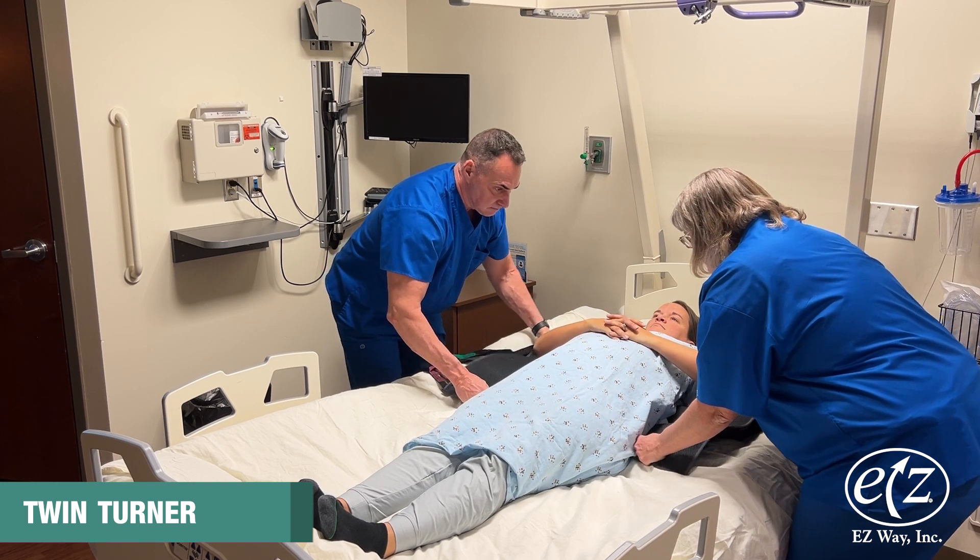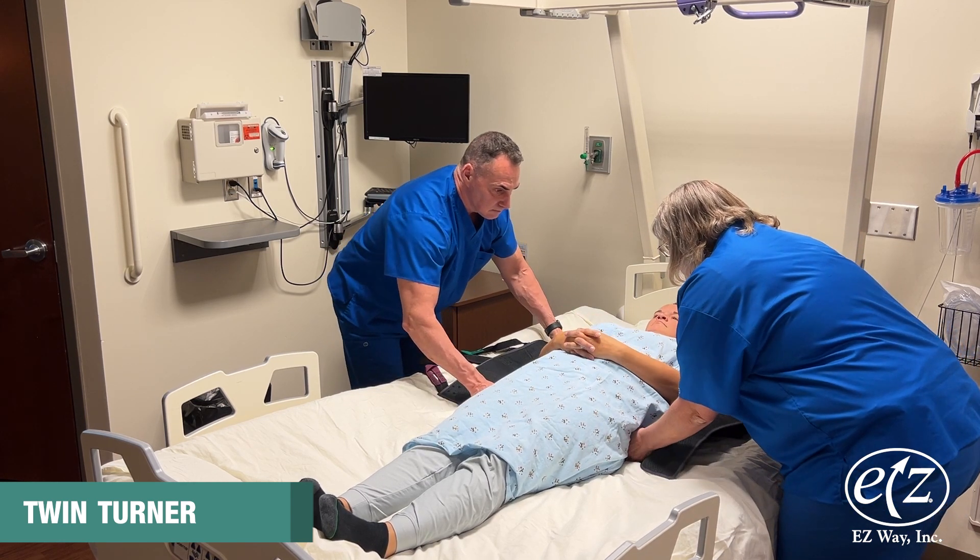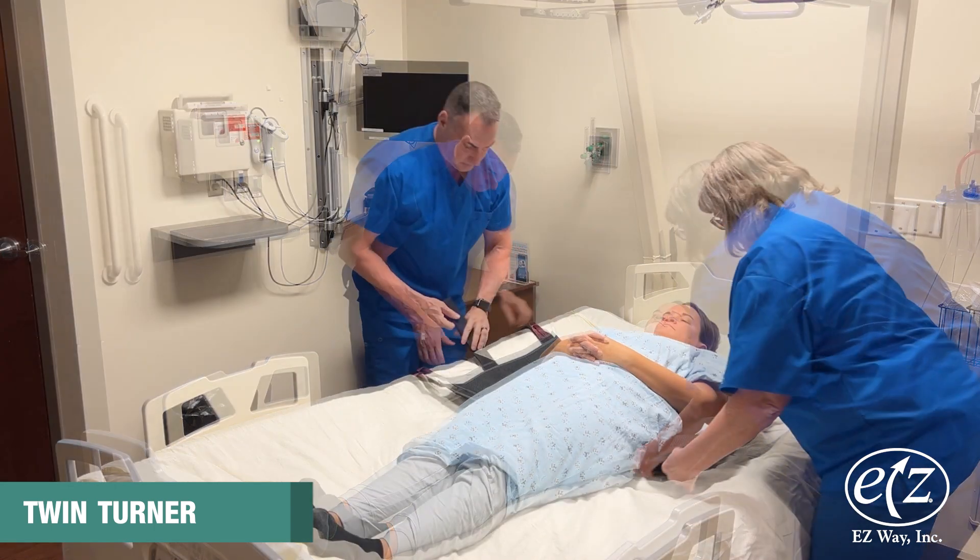Unwrap the folded portion of the sling once it has been pulled through. Make sure the person's arms are not underneath the sling. Placing the person's hands and arms on the chest helps ensure they are not under the sling.